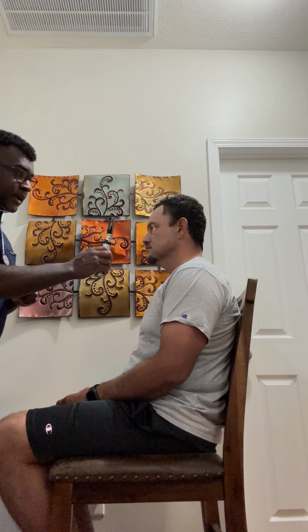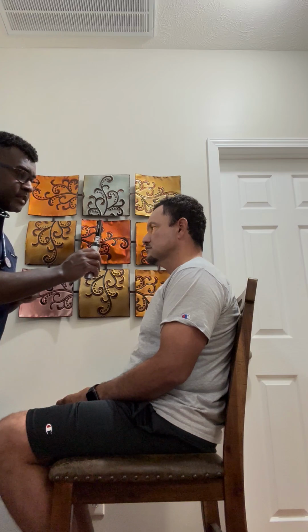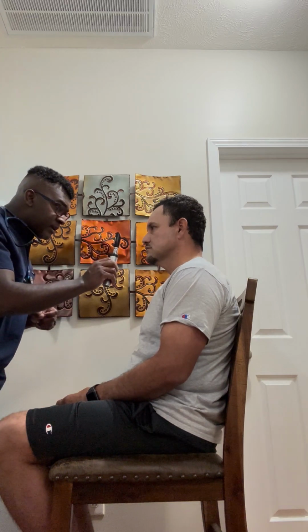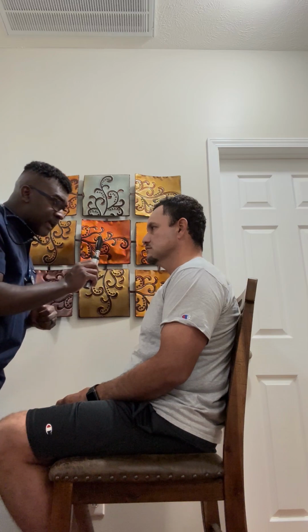looking into the left eye, and then the second is going to constrict with the eye that I'm examining, which is the left eye. And over here, I'm going to shine the light, and it constricts that eye. And then the second shining is going to constrict the eye that's been examined, which is going to be his right eye.